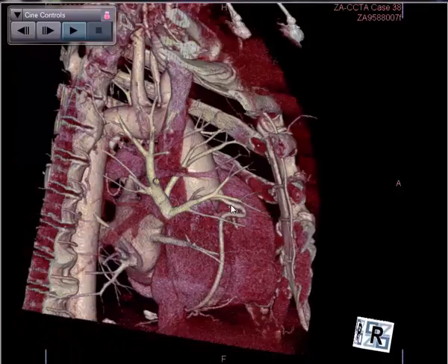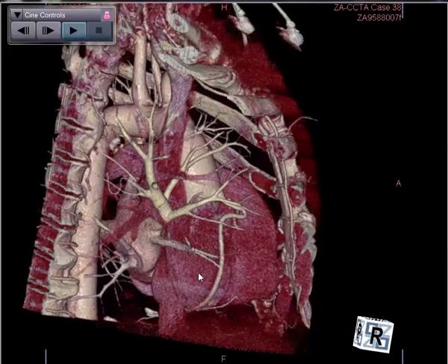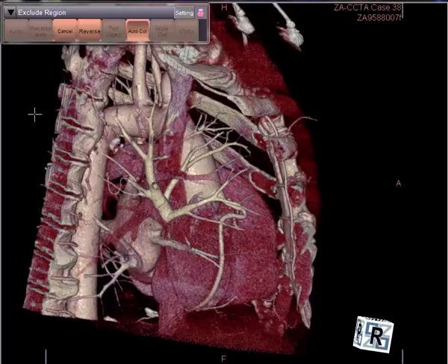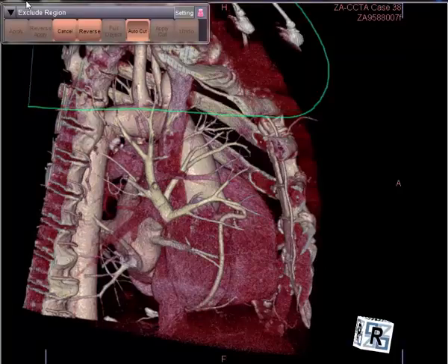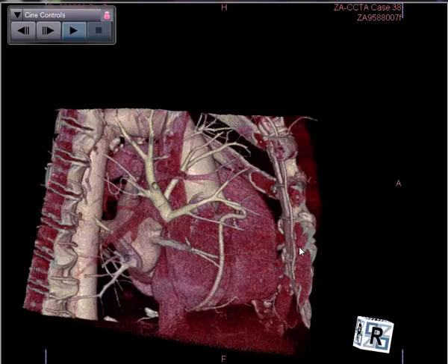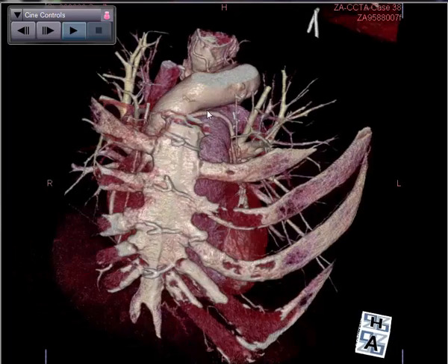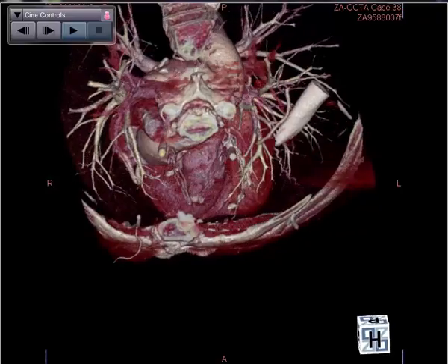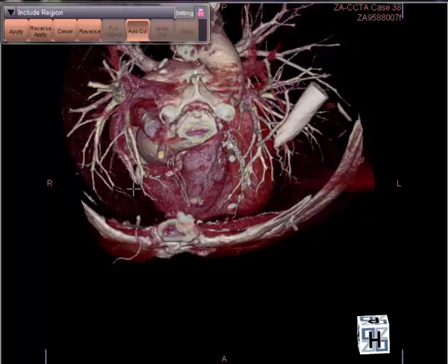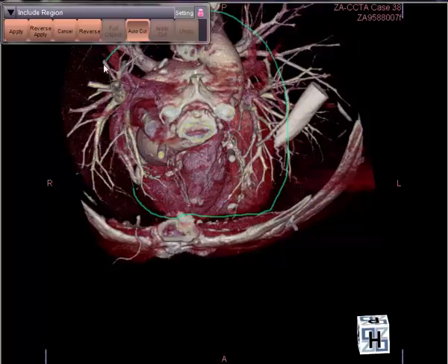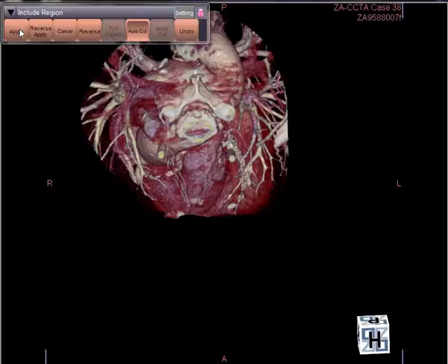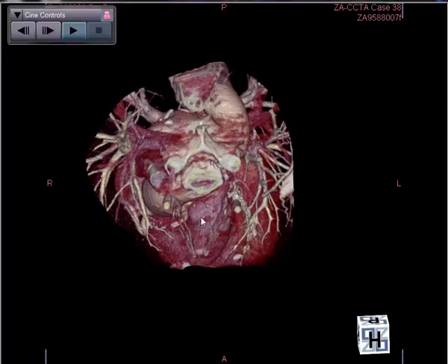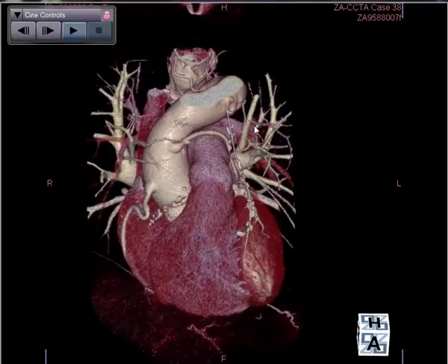One of the easiest ways to figure out where you are is to do some sculpting of the region. I'm going to remove basically the top half of the thoracic outlet here, apply that, and then take another view by rotating around and putting the view as if I'm looking from the head. I'm going to positive this region, rotating around and trying to remove areas of the cardiac surfaces that are not of major interest. I can now see that there are three bypass grafts.